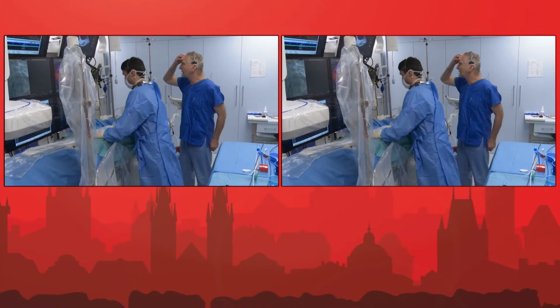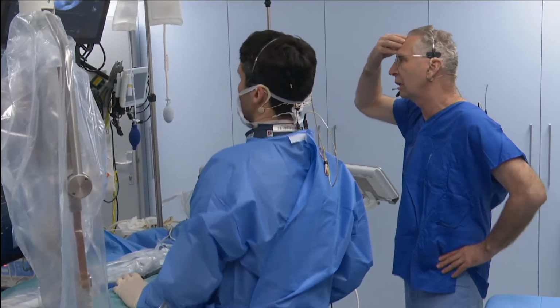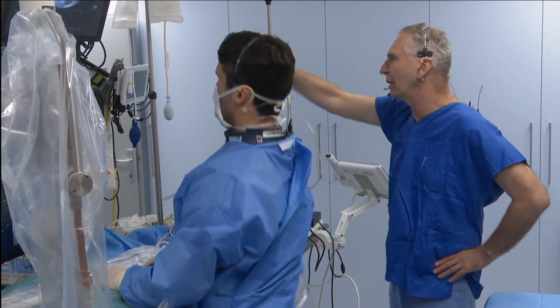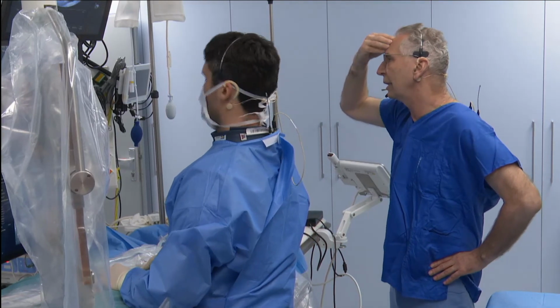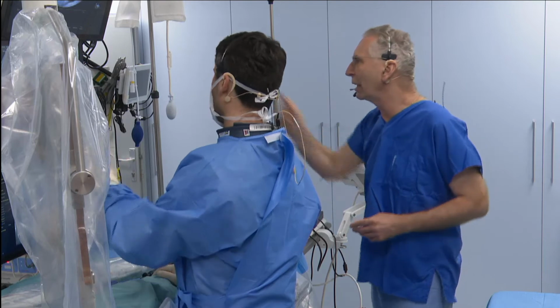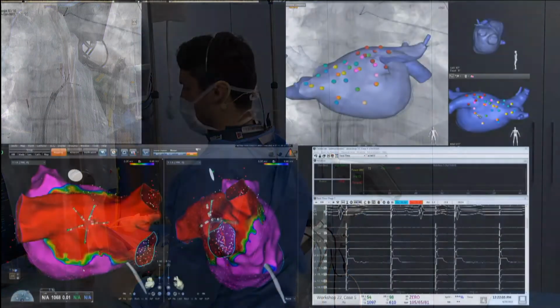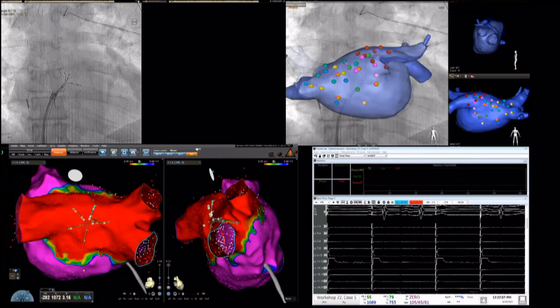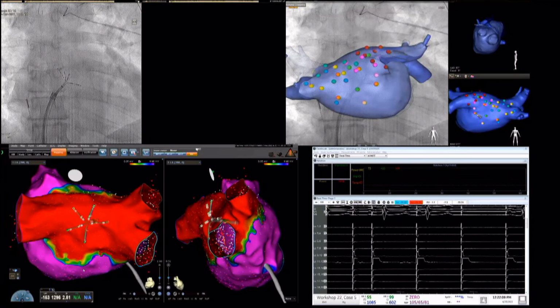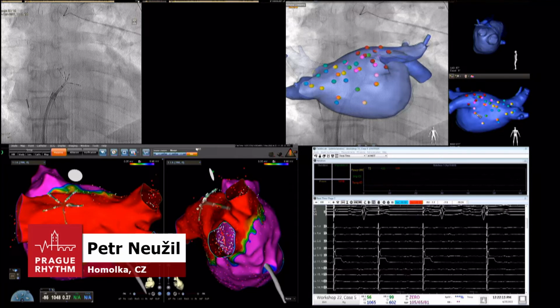Okay, so guys, we mapped the left atrium, and here's a pentaray in the center of the scar. Did you pace it already? Yeah, we can pace it now. But there are no signals from the scar. Maximum pacing from the posterior wall. There is nothing, no capture. So I can move to all parts of the left atrium.